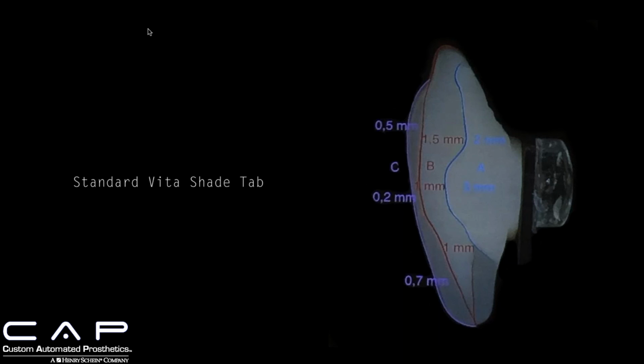I mean, they all measure the same thickness of what would be the body and the dentin and the incisal, and that's great and all. But if you are willing to think outside the box a little bit and look at a natural tooth, there's a lot more going on within a natural dentition than a three-layered plastic or composite shade guide. It's nothing but a color swatch or a tab.